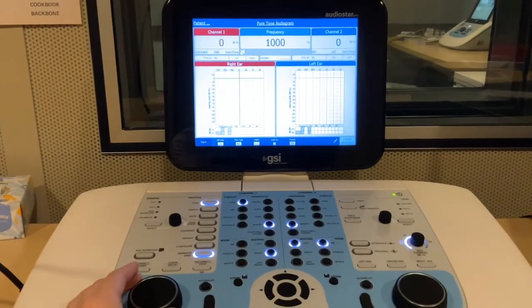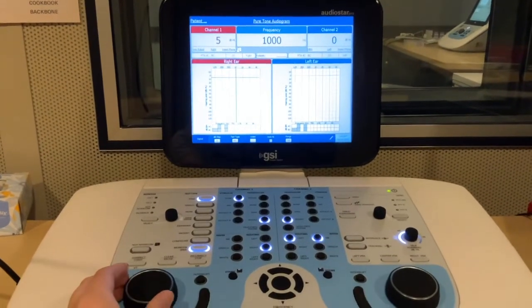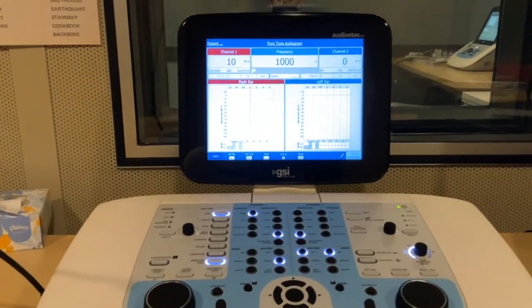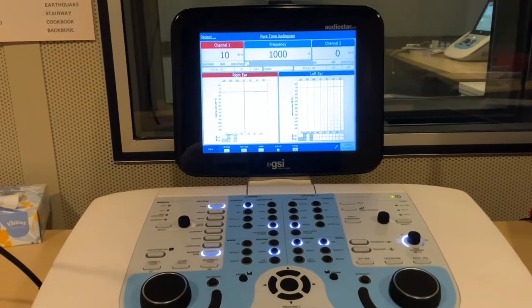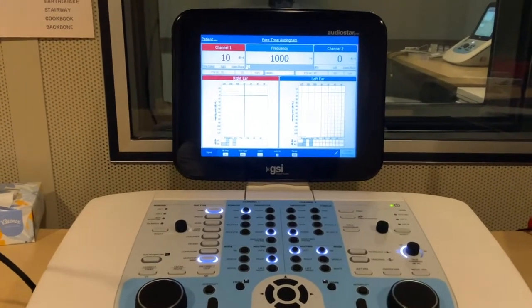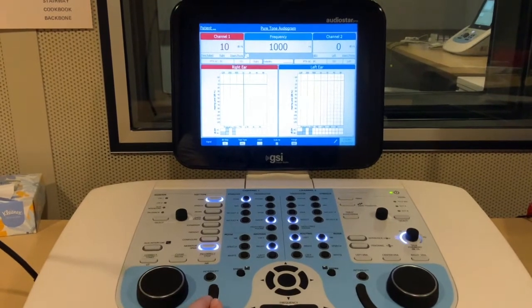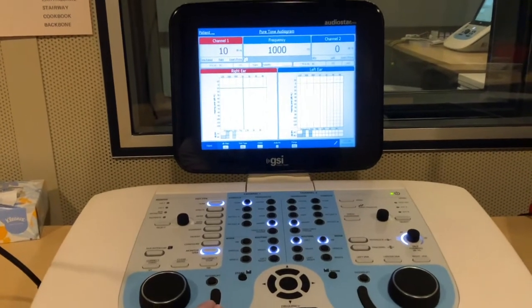So let's go up 5 and present again. No response. Let's go up 5 more dB. And she gave us a response last time at 10 dB. And so what we're looking for is that threshold where she gives a response 50% of the time. Since she already gave us a response at 10 dB, if she gives us another response now, then we're going to take that as her threshold for 1000 hertz. All right, so we have a threshold response at 10 dB for 1000 hertz in the right ear.